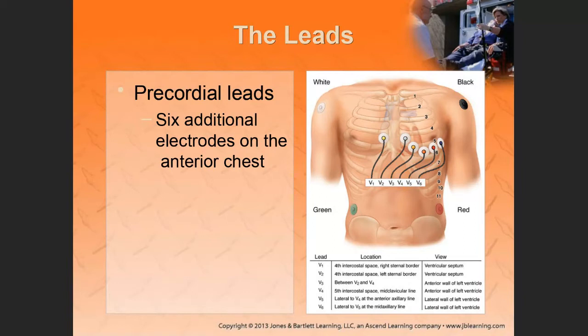I haven't seen the correct answer yet. We're doing a 12 lead ECG. If I'm looking at the left side, which leads? You cannot have AVF in your answer. AVF is an inferior lead.